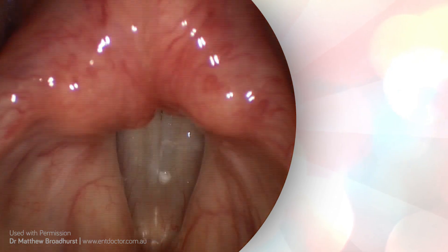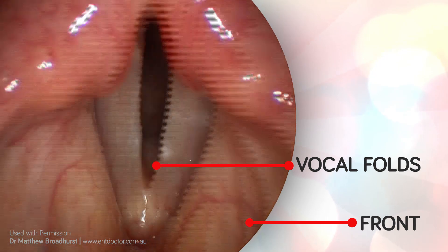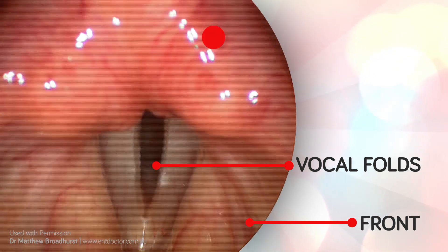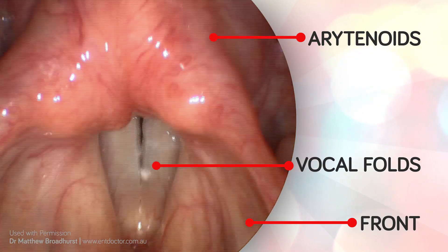The scope has a small light and camera that illuminates and videos the internal workings of the larynx. Here we can see the vocal folds, with the bottom of the screen showing the front of the singer, and the top of the screen displaying the arytenoids, which bring the vocal folds together for speech and singing.